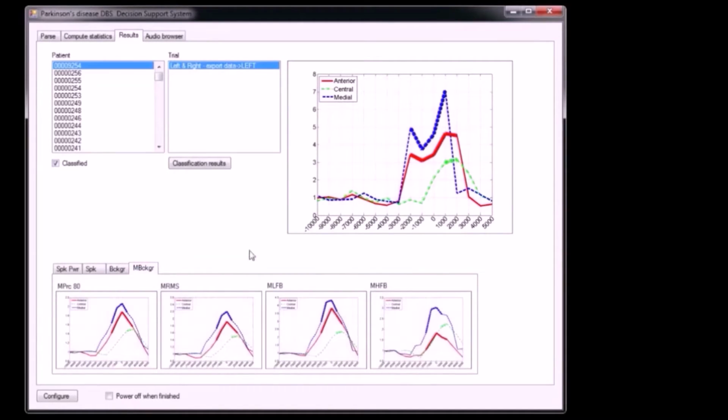The last group is based on this group, and it is simply a moving average with width 5 and with padding 1. The padding 1 is selected because the background attributes are normalized. They are normalized in such a way that for each electrode, the average from the first 5 depths is calculated, and all values of the selected attribute for this electrode are divided by those averages. So, the level of 1 is a typical level of low activity outside of the STN. So, a padding of 1 is safe here, because padding should reflect the areas that are outside of the STN.